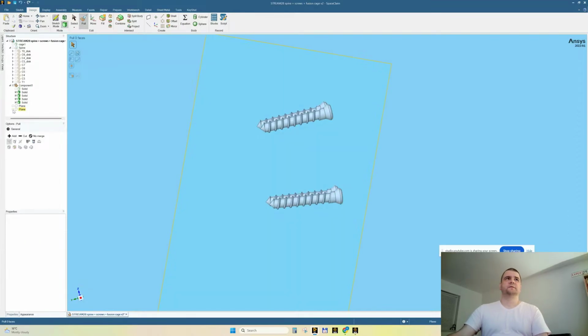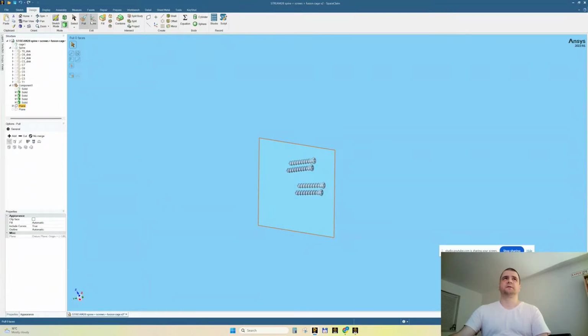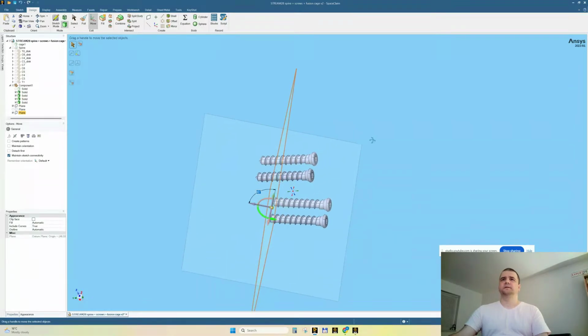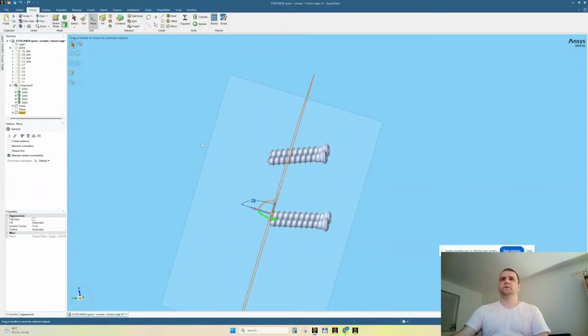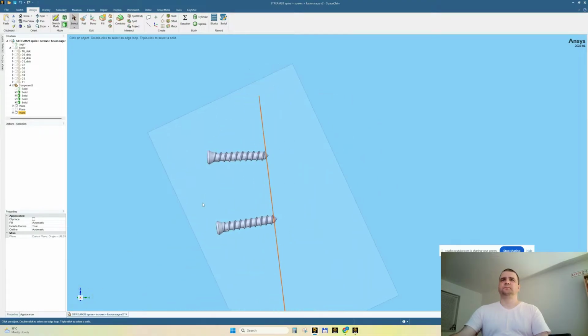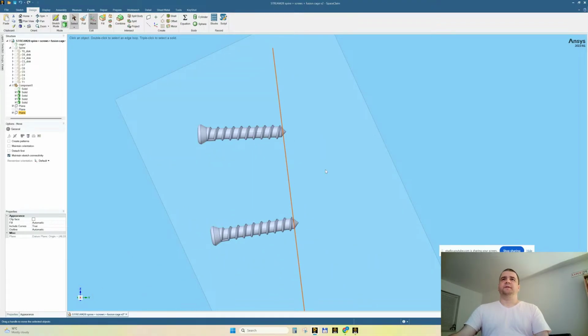Do we have a section plane? We have this section plane, and with control pressed, I'm going to rotate it 90 degrees, and I'm going to cut a bundle cut. I don't want precision. Let's select this plane and move it.